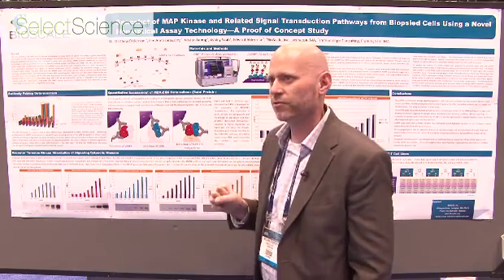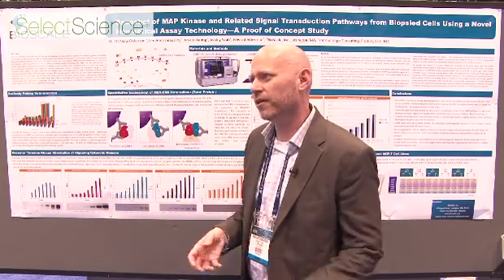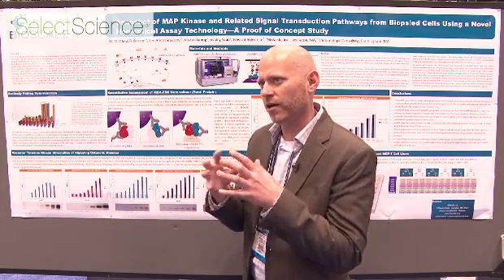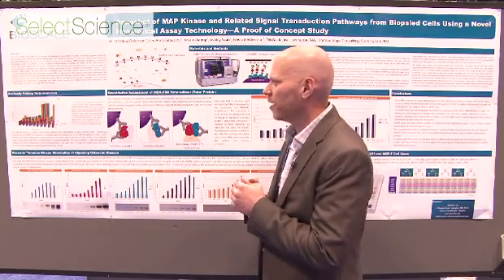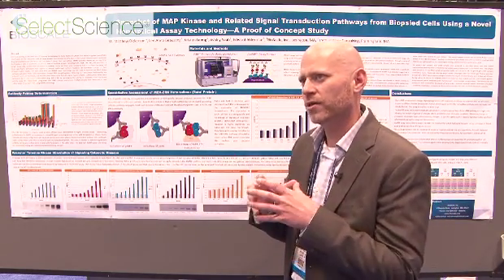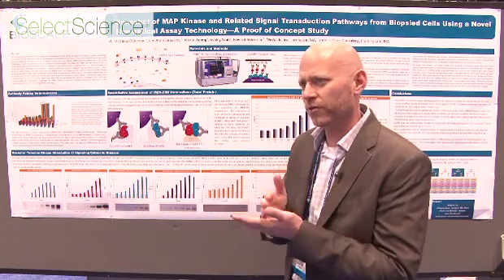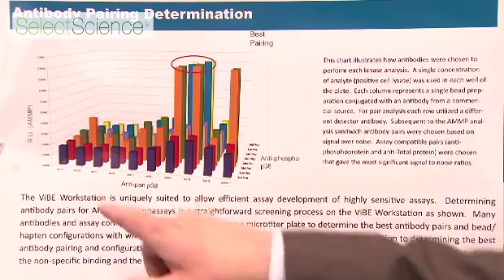So how did we set out to do that? In order to develop these assays, they are classic sandwich assays in which you have 2 antibodies coming together to bind to the analyte and detect the analyte in your sample. And that's done in our technology all as one gemisch. So we put everything into a well at the same time. So we're simultaneously measuring everything in the state in which it's presently presented to us in the sample. The way that we do that is illustrated here.